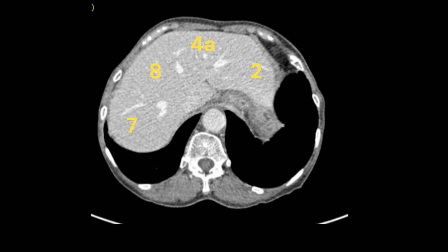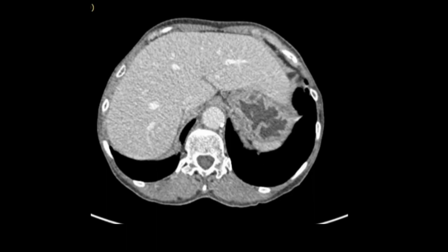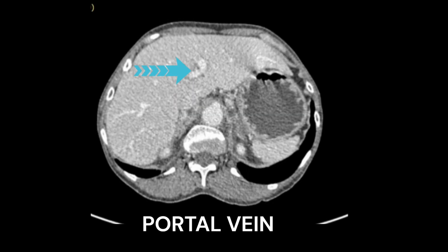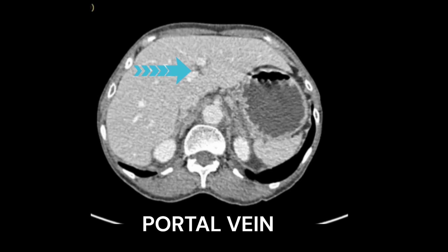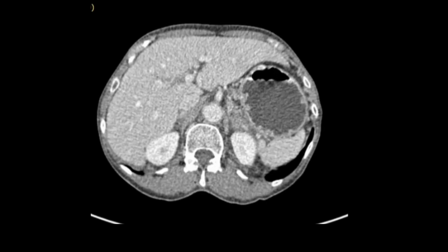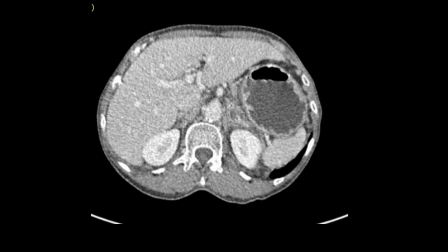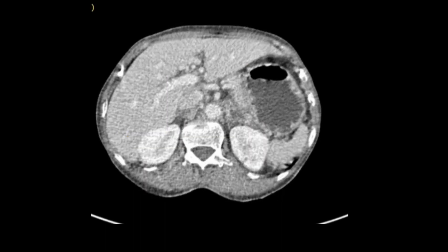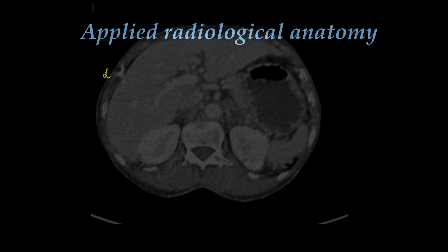In the sections above the portal vein on CT, we can see segments 2, 4a, 8, and 7 — with 8 being anterior and 7 posterior. Moving down where the portal vein divides the liver into superior and inferior segments, and then below the portal vein, we see segments 3, 4b, 5, and 6. Again, segment 5 is the anterior segment and segment 6 is the posterior segment of the right lobe.